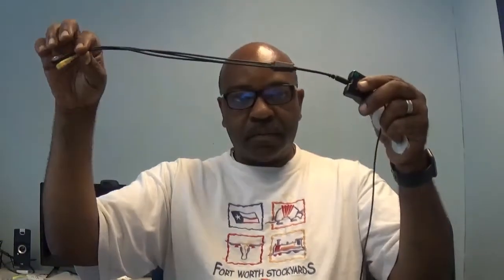So now if we're going to use this type, we don't snap it directly into the preamplifier. We use the extender cable, plug that in. So now we can snap these in.